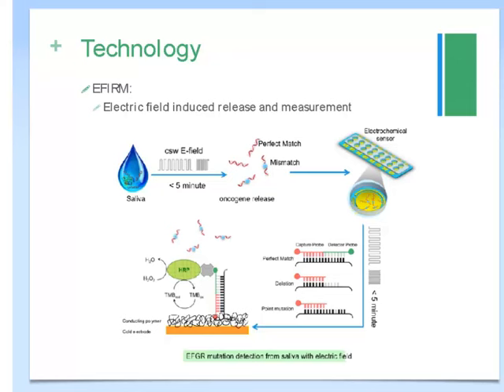The process of detection is based fundamentally on the principle of molecular hybridization, except it's miniaturized and the rapidity of the process is a fraction of a typical hybridization-based mechanism. So within minutes, we have the ability to attract those molecular targets to an electrical surface where a capture probe can pinpoint the mutation to be interrogated, and then an enzymatic reaction leads to a rapid redox reaction that allows a very sensitive readout of the presence or absence of that mutation.